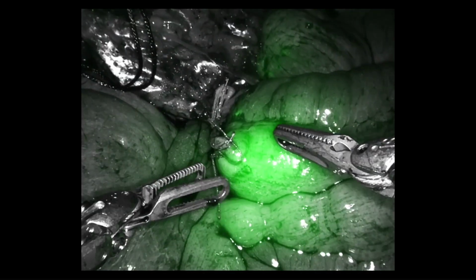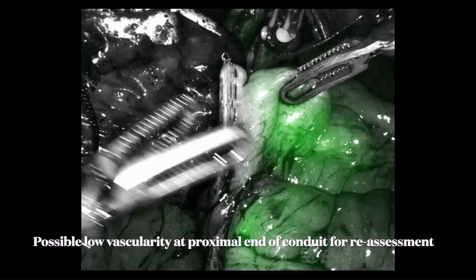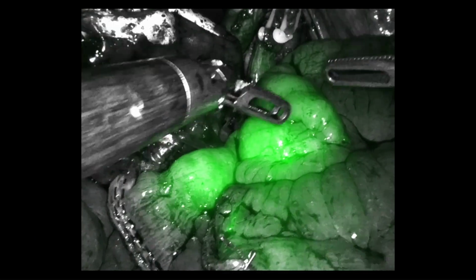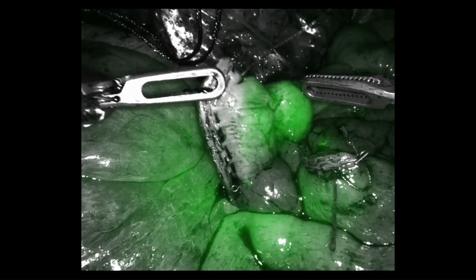We also check the perfusion of the ileal conduit. The proximal end of the ileal conduit in this case looks slightly less perfused, which we left to be monitored intraoperatively. The distal end of the ileal conduit seems fine. After this, we prepare for the bowel anastomosis.